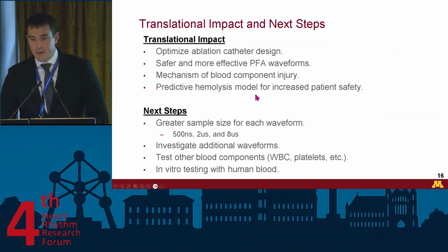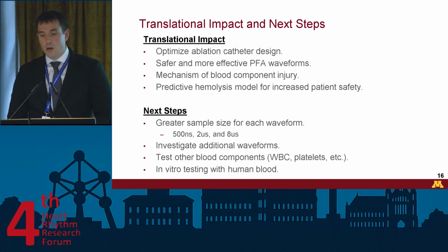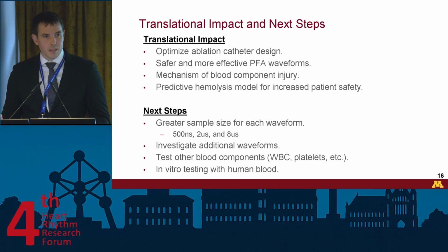So the translational impact is going to be to optimize ablation catheter design and create safer and more effective PFA waveforms, understand the mechanism of blood component injury at each of these aspects, and create this predictive model for increased patient safety. The next steps are to have a greater sample size, investigate more waveforms, like I mentioned, there are quite a few to play around with on the LPOR system, test other blood components like white blood cells and platelets, which could potentially be helpful to clinicians, and ultimately test this with human blood in this in vitro setup.